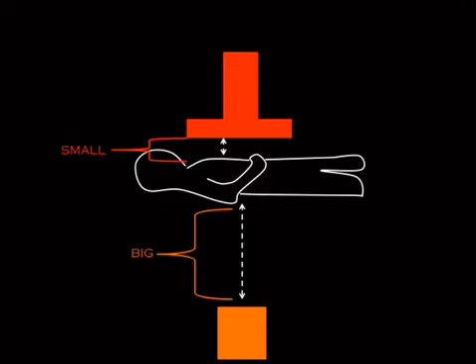Now, having the image intensifier as close to the patient as possible is going to do a couple of things for you. One, it does decrease dose to the patient because the automatic brightness control is trying to make a pretty picture. If you have more X-rays actually being detected because the II is closer, the automatic brightness control is not going to increase the MA as much to make an adequate picture.